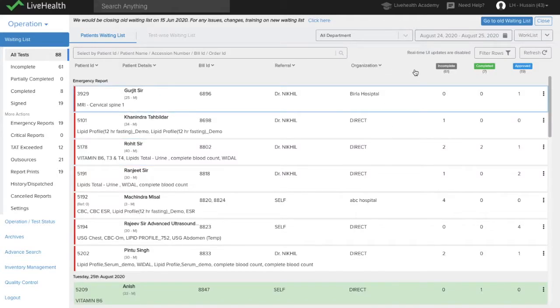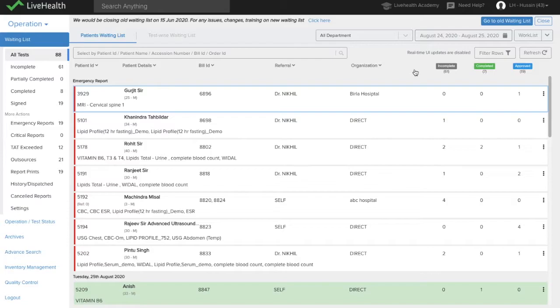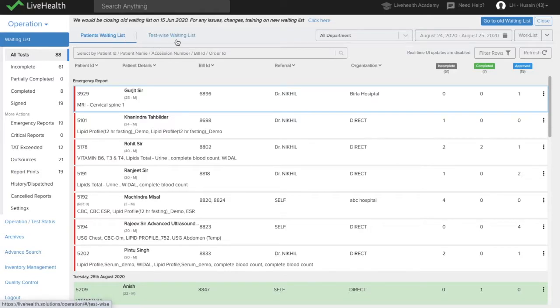Let us see how you can use the waiting list to improve your workflow and productivity in lab operations. So mainly there are two views in the waiting list, patient-wise waiting list and test-wise waiting list. These are the two views which are available.